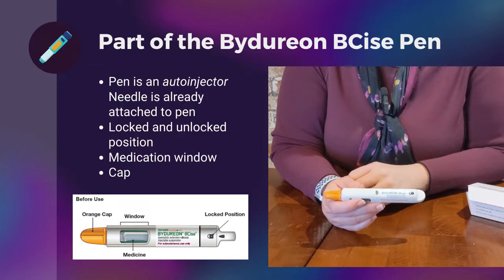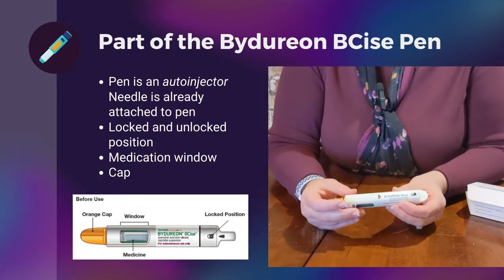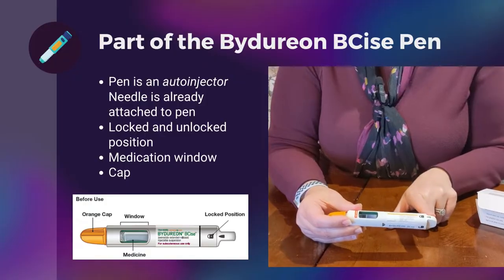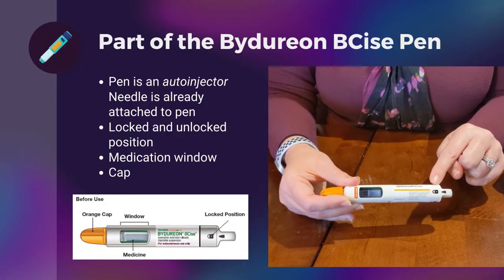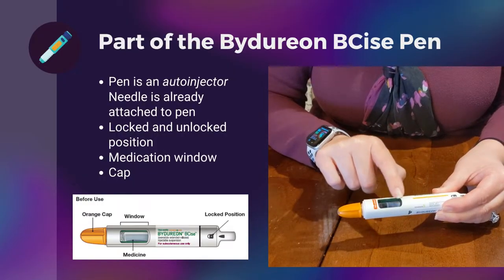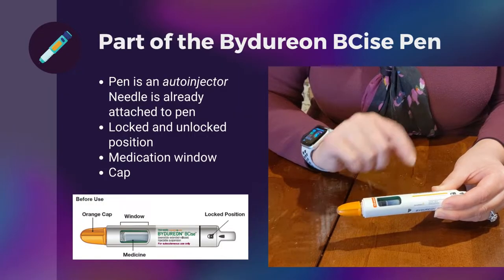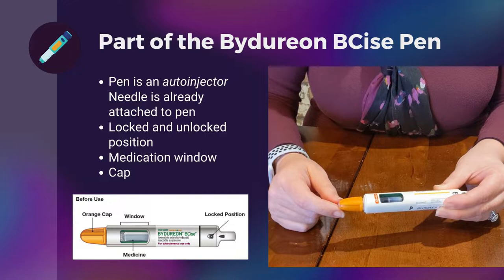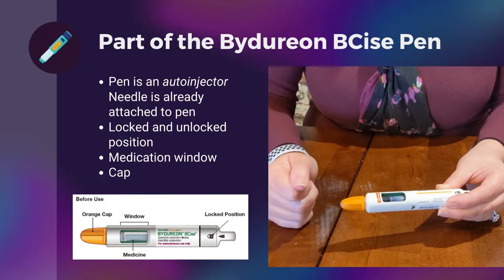It is an auto-injector, so the needle is already contained in the pen. Some things I want to bring your attention to: before you give your injection, this arrow should always be pointed at the lock. We're going to talk about this dosing window in a second when we get to preparing the pen for injection. And finally, this orange cap is what you're going to remove when it comes time to give your injection.